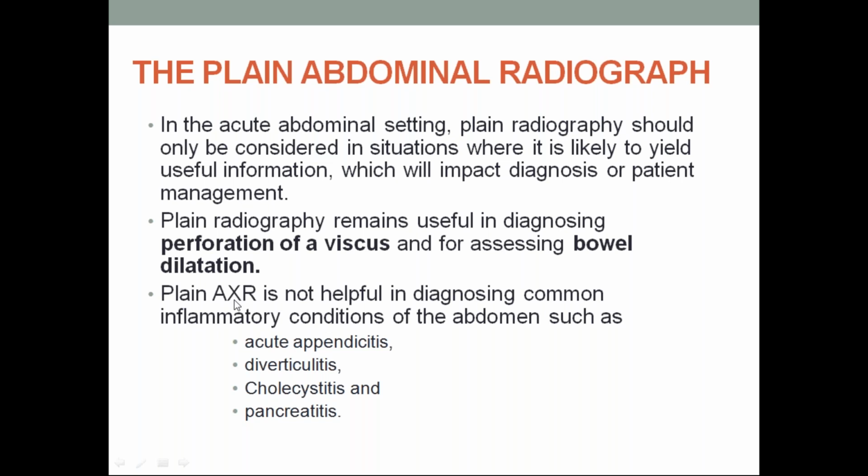It is not useful in diagnosing common inflammatory conditions of the abdomen, such as acute appendicitis, diverticulitis, cholecystitis, and pancreatitis. Please make a note: any inflammatory conditions of the abdomen will not be recognized on abdominal radiograph.